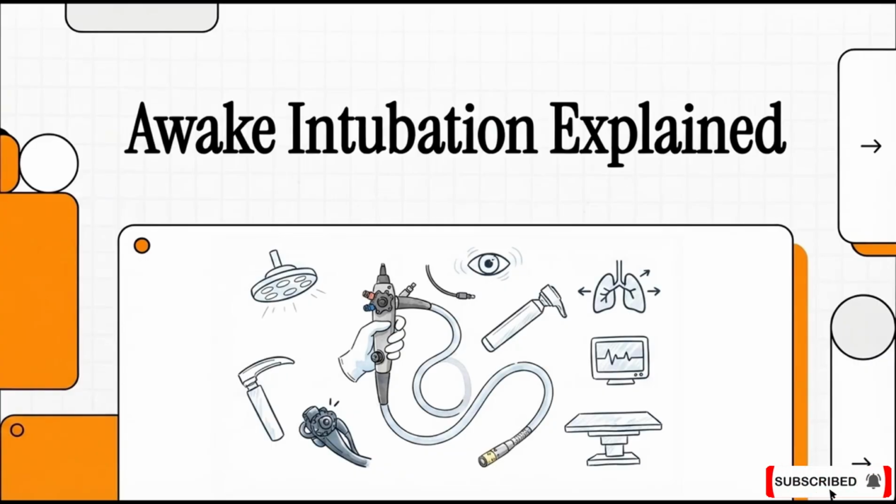Picture this. A patient is lying on an operating table in a bright, modern OR. The anesthesiologist is standing right at the head of the bed, holding a laryngoscope and a flexible bronchoscope. You know, the camera and tools they use to navigate the airway. But here's the crazy part. The patient is entirely conscious. I mean, they are breathing completely spontaneously, wide awake, just staring up at the ceiling.